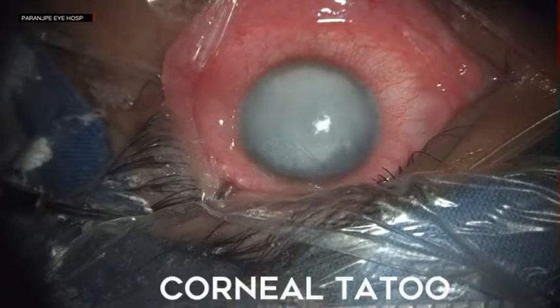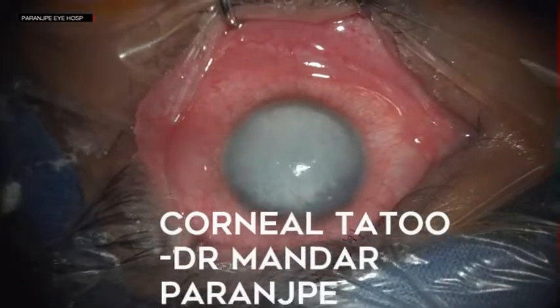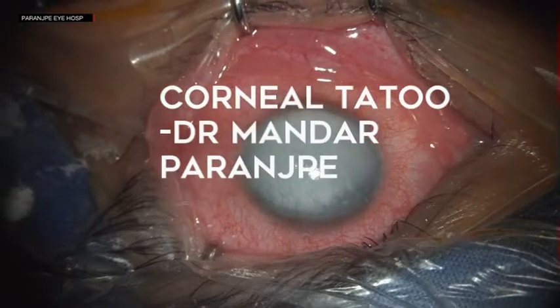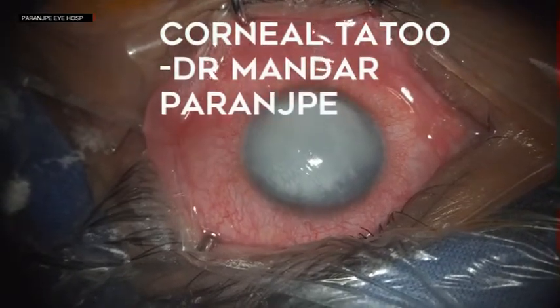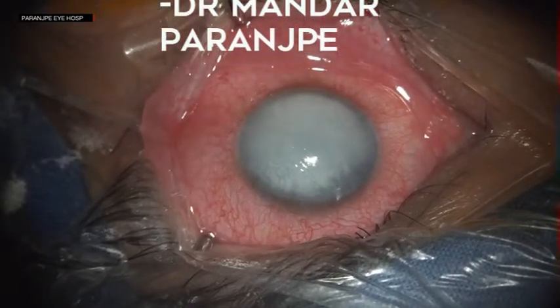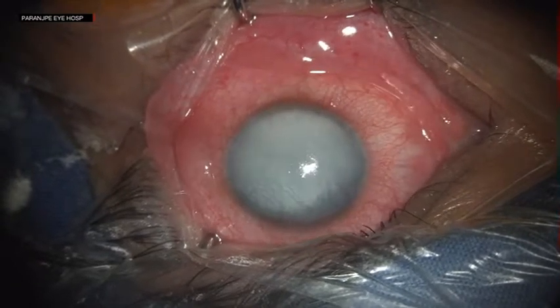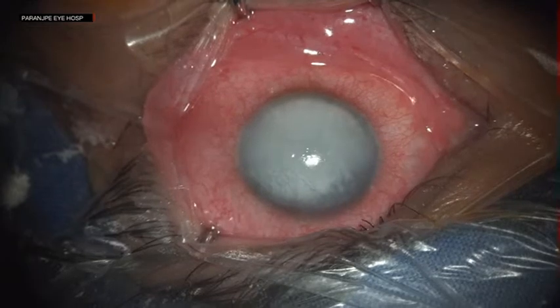Corneal opacities can be disfiguring for any patient. In this video, I share a corneal tattooing technique which has been popularized recently using a tattoo gun. As you can see, this patient had a total corneal opacity.